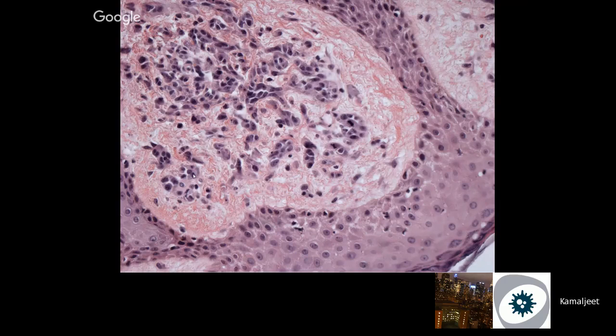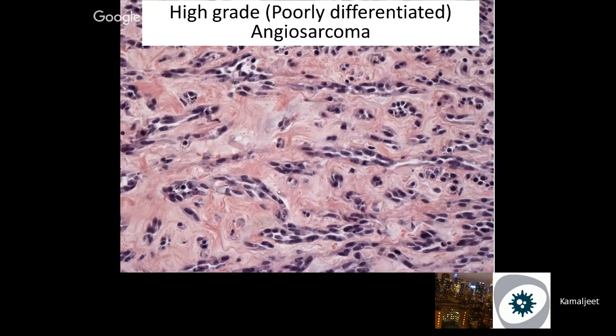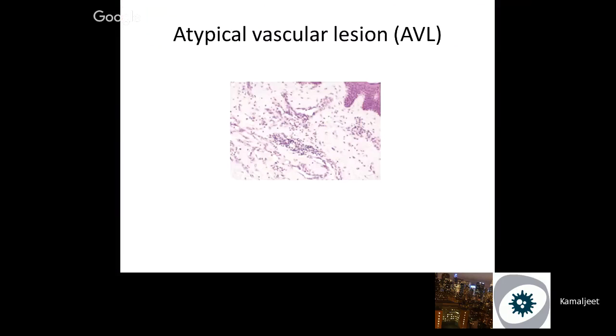The key here is nuclear atypia. They can look epithelioid or spindled. They are forming vague sinusoidal structures. There is mitosis. It's malignant, extending up to the dermis, diffusely involving the periductal tissue. And the diagnosis will rest on immunostains. You'll have to stain it and prove it's endothelial with CD34, CD31, ERG, to call it a high-grade angiosarcoma.